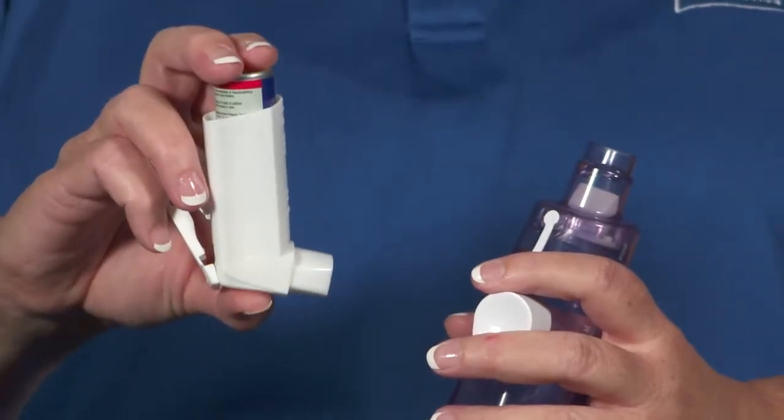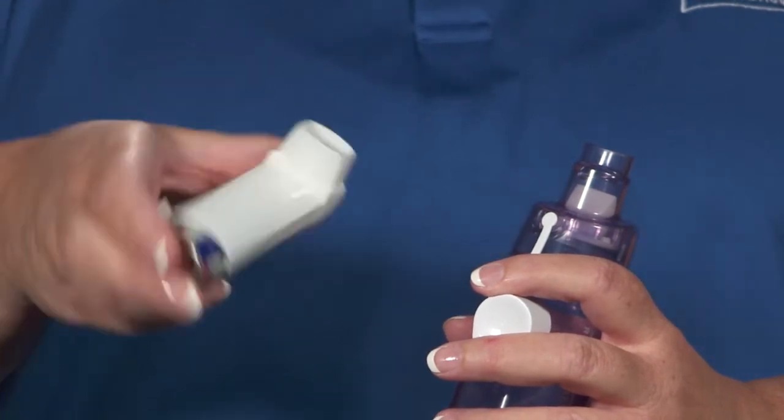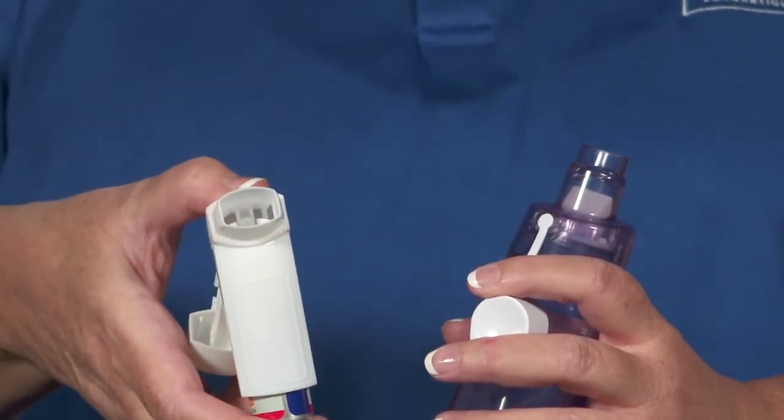Hold the MDI upright, because the propellant is gravity dependent for most devices and will not work properly if used upside down. While holding it upright, shake the device for at least 5 seconds before each use.